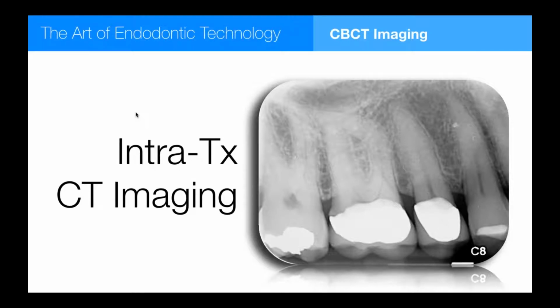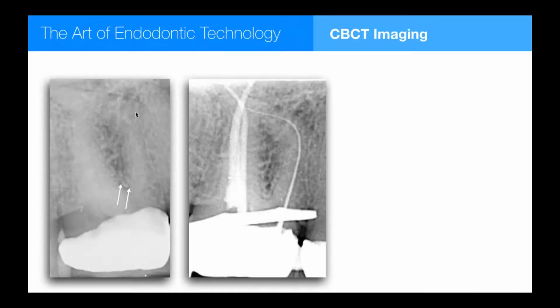And after you learn that you're going to probably want this for every single endodontic case you ever treat, you're then going to take the next step and find out there are cases where you're going to have to actually get another CBCT image set in the middle of treatment. For instance, if you can't find a fourth canal. This is another live demo case. Unfortunately, this one did have 4 canals, as shown on the shallow distal conventional view.